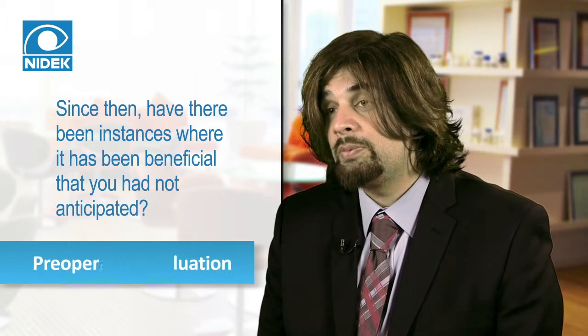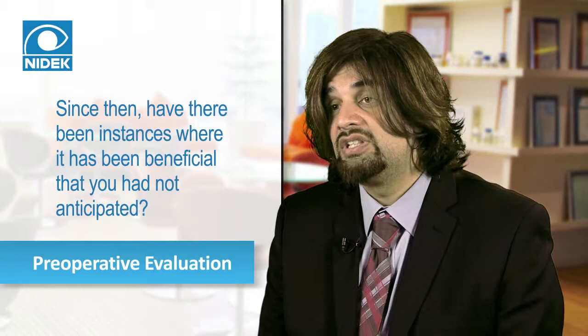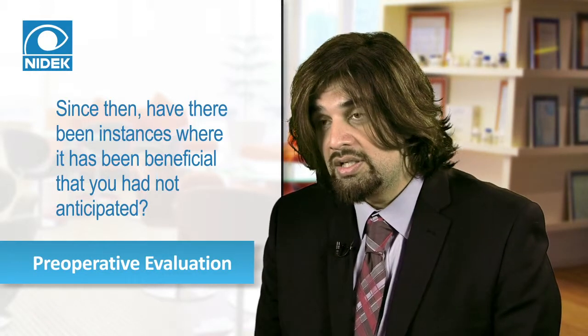Furthermore, it also helps us to evaluate the selection of, for example, multifocal lenses. We know that spherical aberration and other higher order aberrations can be concerns in certain IOLs. I think it's very important to preoperatively evaluate that before operating on a patient, number one, just to discuss potential concerns with the patient. And number two, in terms of selecting patients, we might want to avoid multifocal lenses, for example, in patients who have significant horizontal or vertical coma, or patients who have a significant amount of spherical aberration. So that certainly has been of value.